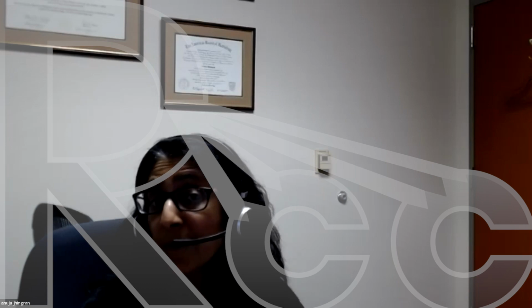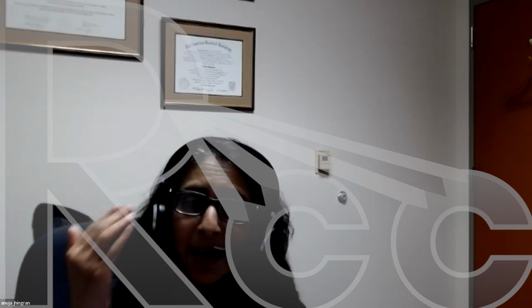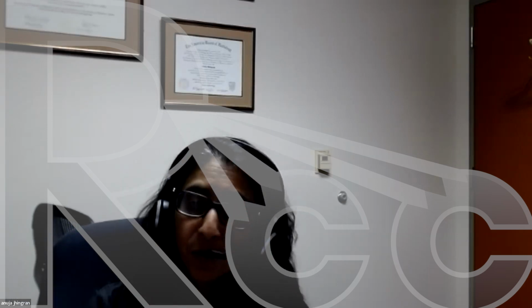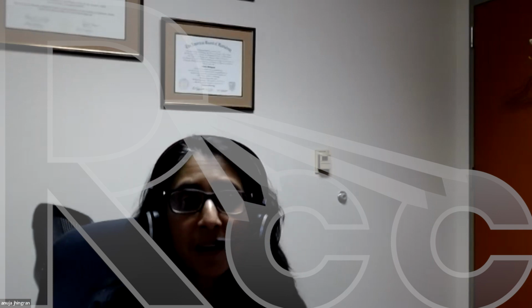It's the same standard for cervix, which in my mind doesn't make as much sense, because you're taking more of the vagina out when you do the cervix. So do you really need to do the vaginal cuff boost? But that is our standard for all post-op patients. So it's 45 and it's 2 vaginal cuffs.